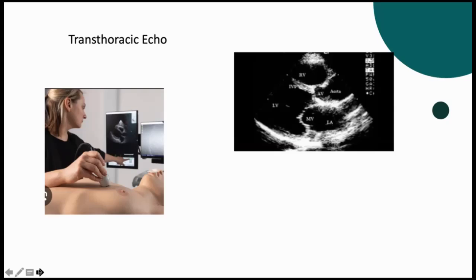I think I have shown this once in the ICU or in the theater to you. So then we'll do that. If one person knows it, next time teach another person, so it will register in your mind. Keep on doing this, then your skills also go on, and you get the real picture of the patient. It's quite fascinating to see what happens to his heart when you do something to the patient, right? So it is very important to see, because in a rush, if you had to see a pulmonary embolism intra-op, this is an easy way, especially if you can get access to the thorax.